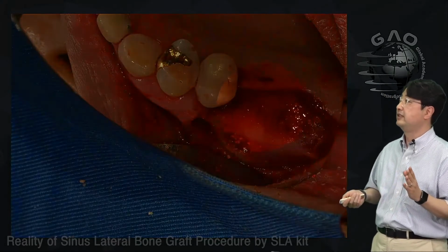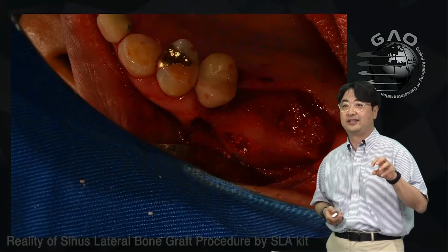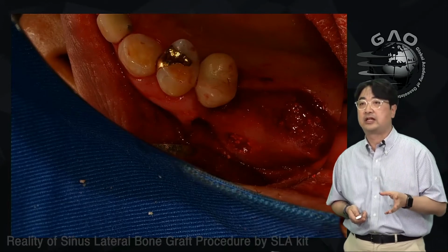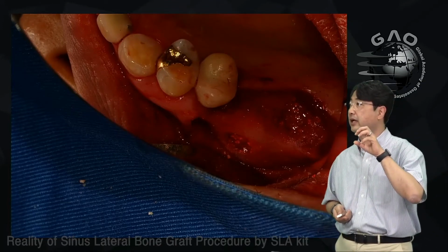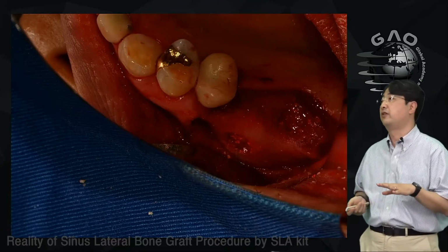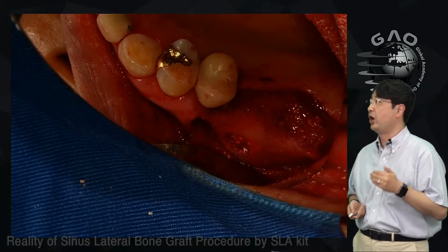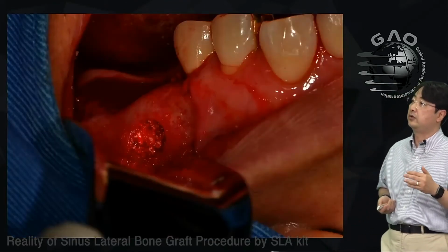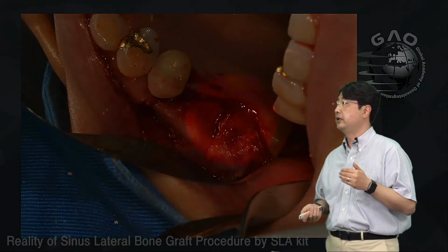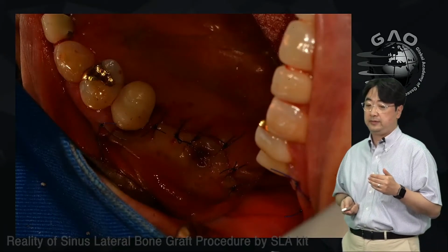I did the bone graft not from the lateral window, I did the bone graft through the crestal part. I made the lateral window to dissect the tearing membrane, right? And I did the bone graft on the crestal area, from the crestal opening. Okay, so here you can see the bone fill, right? And I covered the crestal opening with the PRF membrane, and I closed the suture like this.